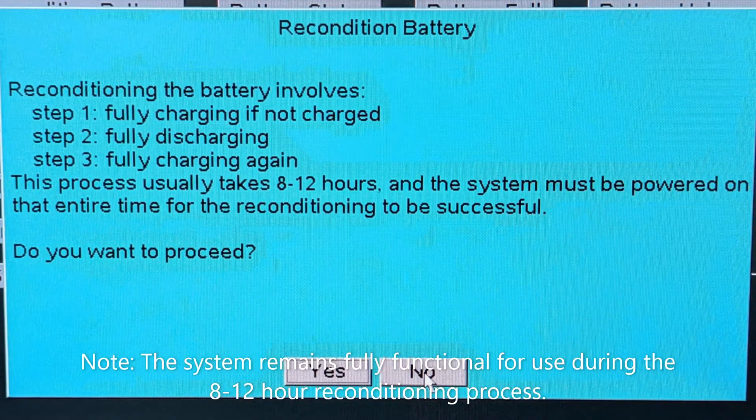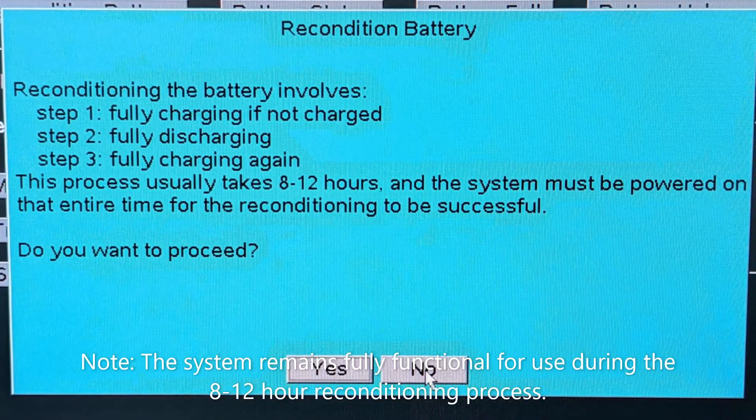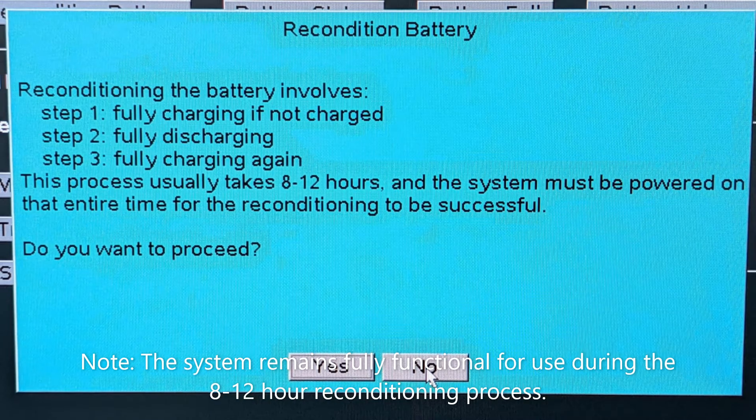Note: the system remains fully functional for use during the 8-12 hour reconditioning process.